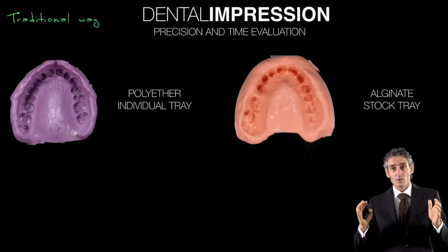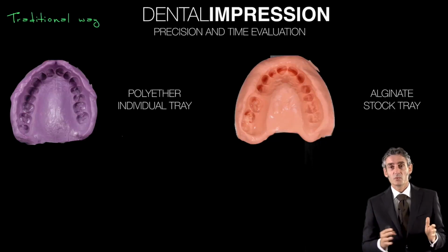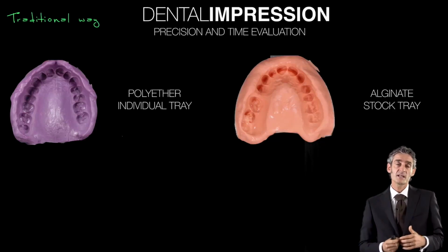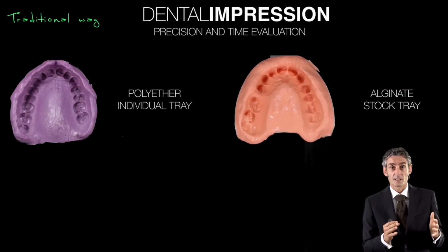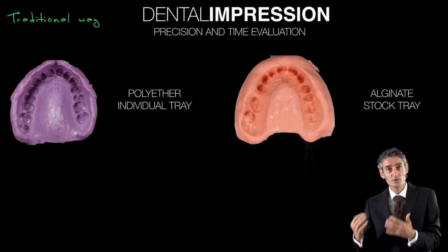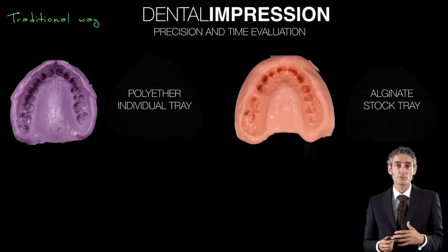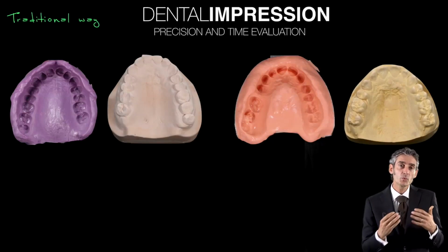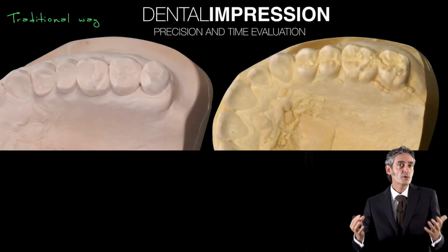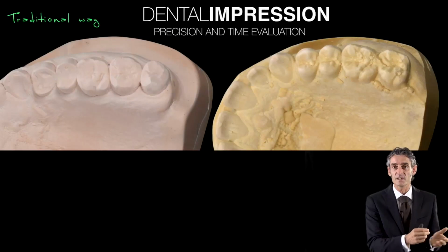So normally, where do we start from? We start from an impression, a digital impression or a traditional impression. And then if I start to analyze the differences, remember that the traditional impression has some problems as well. If you don't take a really good impression, it means with the right material and in the right way, what we have are casts that sometimes can be not perfect, so can have a lot of bubbles inside the grooves.